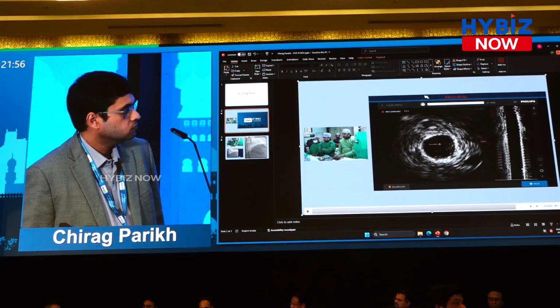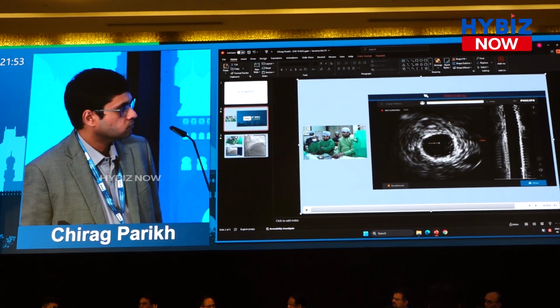That's very important. When you say neoatherosclerosis, it is the development of atherosclerosis inside the stent. This is outside the stent. This is peristent, called stent edge restenosis. That means when you land in an improper landing zone, especially if there is a geographical miss, most likely lipid-rich plaque. So when you implant the stent, see that your landing zones have less than 50% plaque burden. Especially lipid-rich plaque should be avoided. In such cases, the restenosis rate is very high.